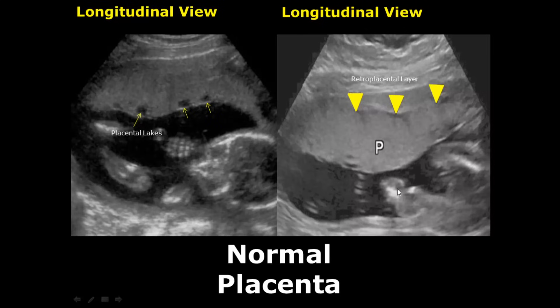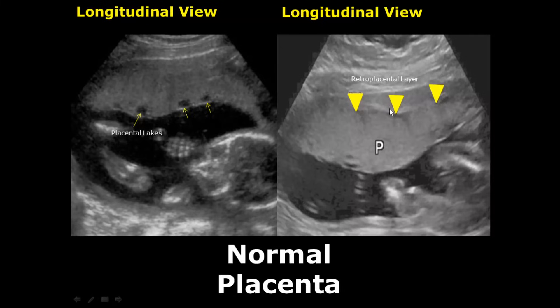Here you can see small hypoechoic areas inside the placenta — these are venous lakes or placental lakes, and these are normal occurrences. You may also notice a hypoechoic layer behind the placenta; this is known as the retroplacental layer.